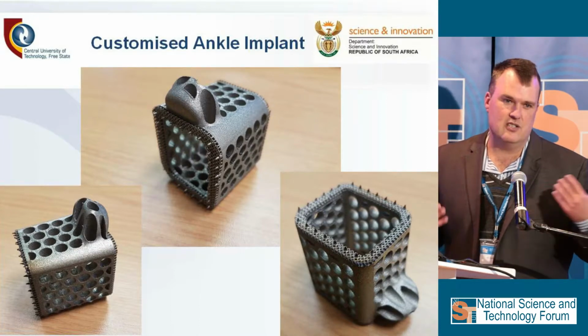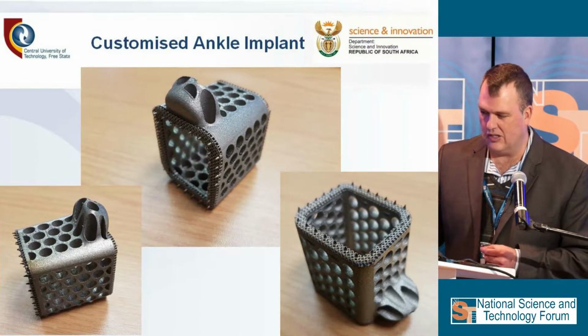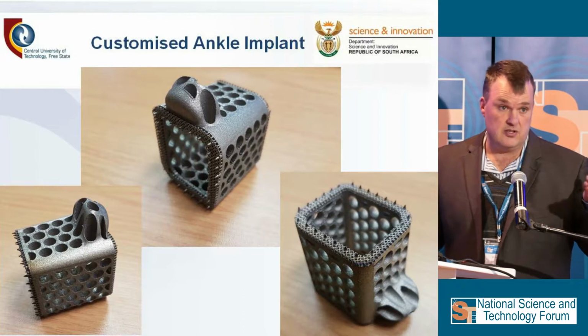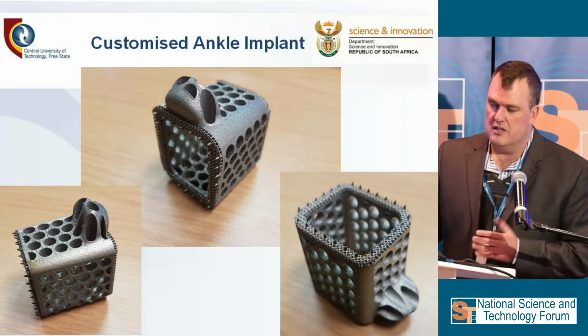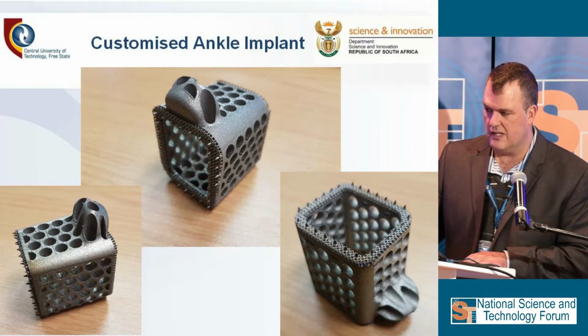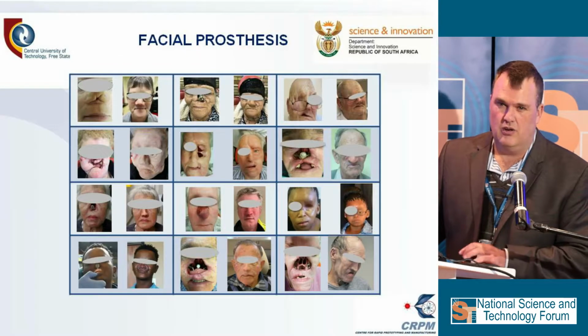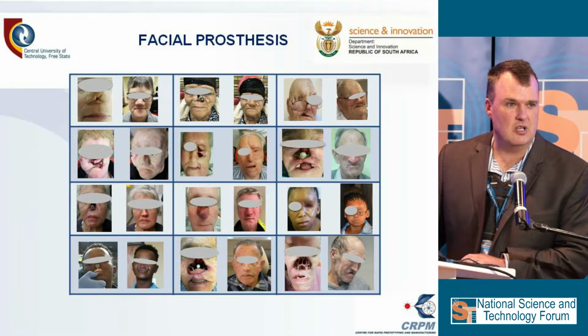And it's not just that I decide today I want to try this and put it into a patient. That's not happening. Even though we are sticking with the Ti64 material, even the designs, there must be product risk assessment and process risk assessment. So now, these are quite sensitive slides.